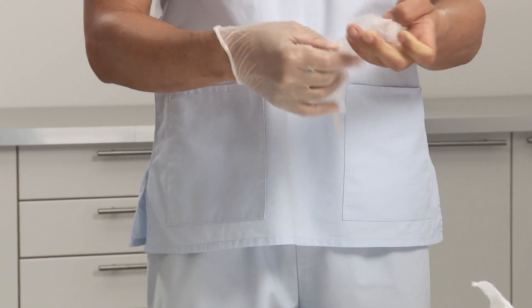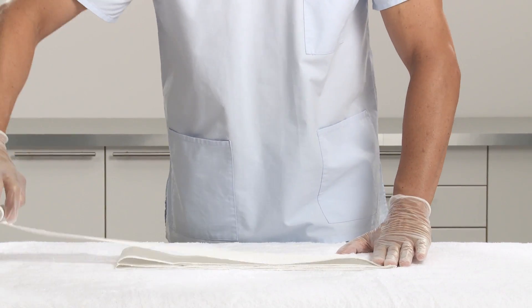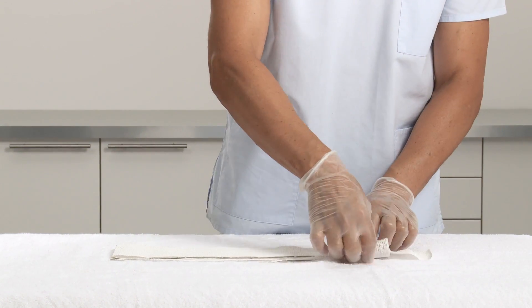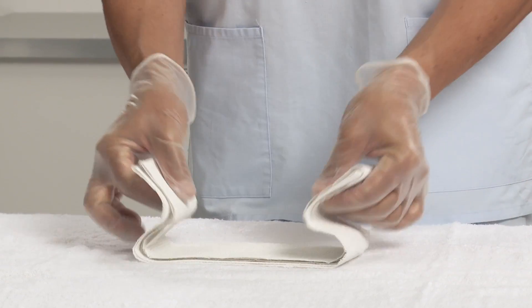It's recommended to wear protective gloves before applying Plaster of Paris. Select the appropriate width of the Plaster of Paris bandage. Fold the bandage into six layers at the length needed to fit the patient, and pick up the bandage in a zig-zag shape.